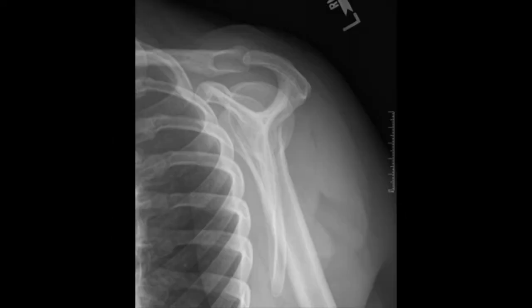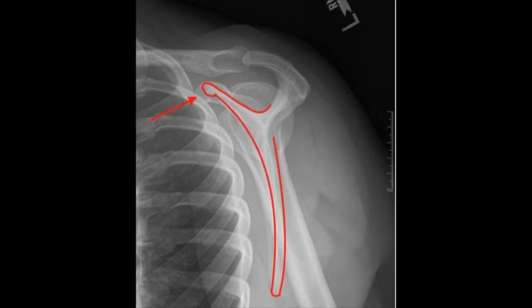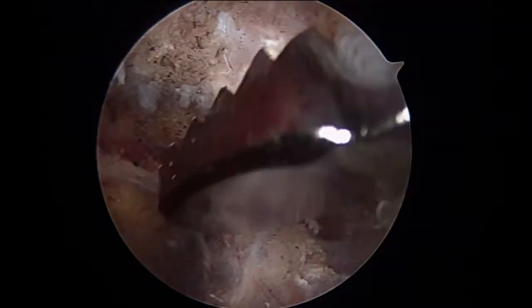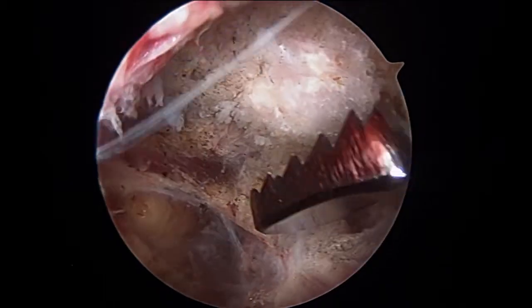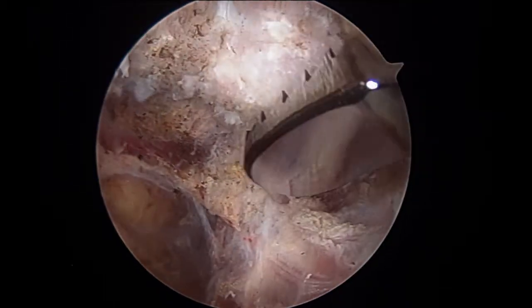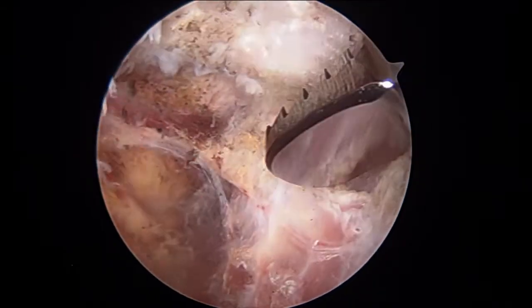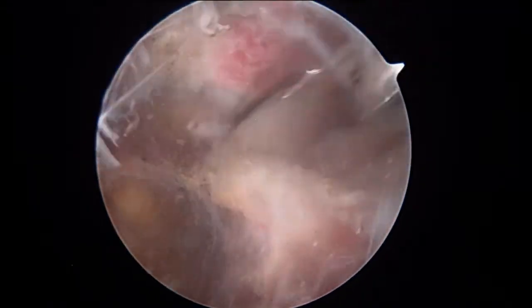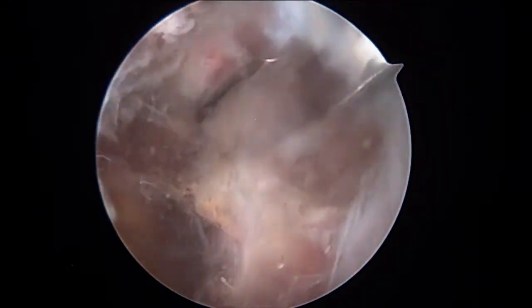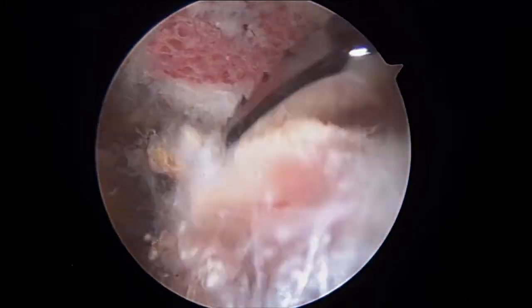In our second example, the cause of the painful popping is a little less obvious. You can see I've outlined it here — there's a bone spur at the medial angle of the scapula and it's rubbing on the chest wall. So again in this case, we're going to arthroscopically go underneath the shoulder blade, remove the bursitis, and instead of locating a bullet fragment, this time we're going to locate that bone spur underneath the shoulder blade.